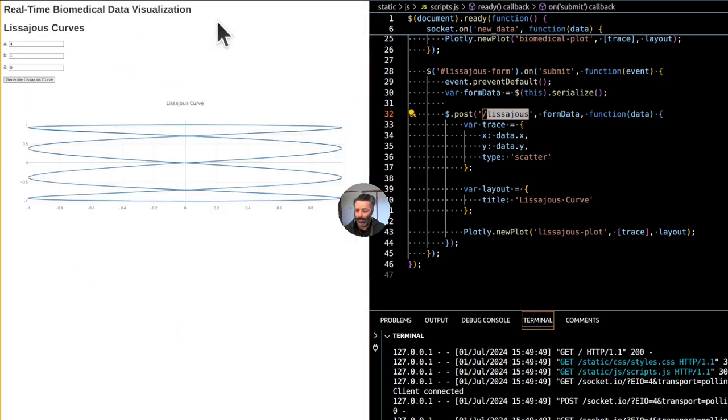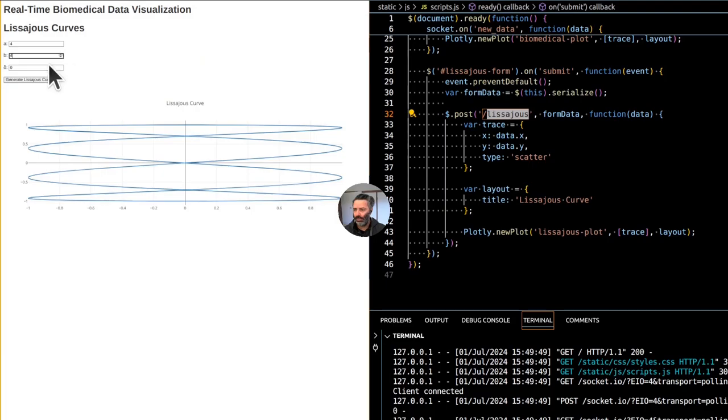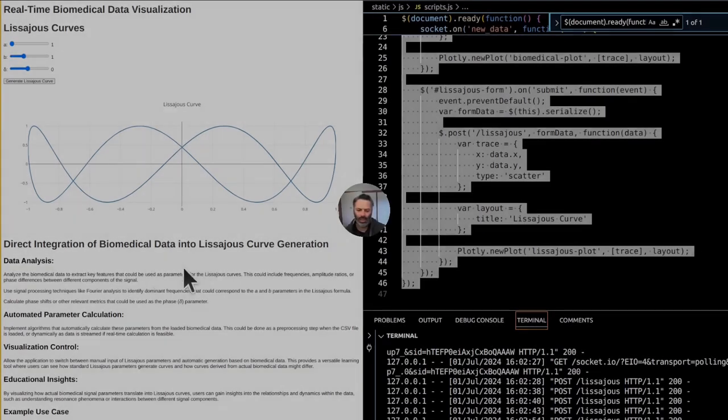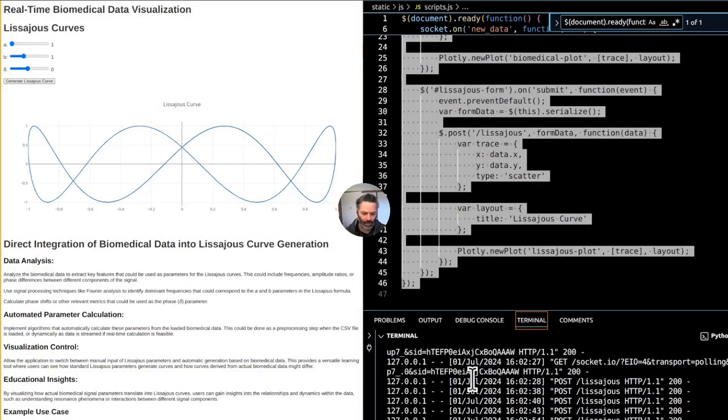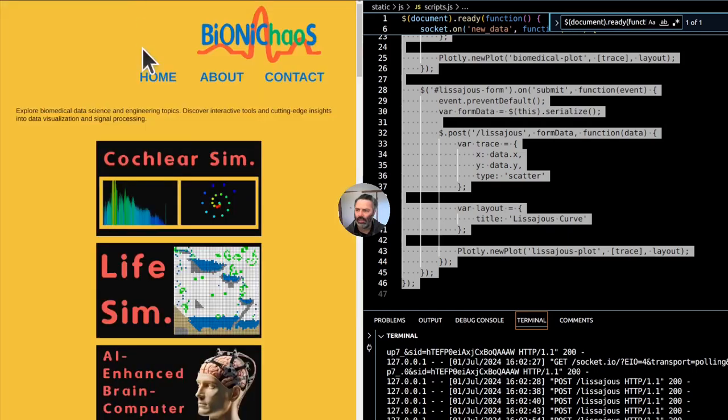Currently, we only have the curves themselves. You can change parameters. Yeah, we like how this one looks. It's pretty nice.